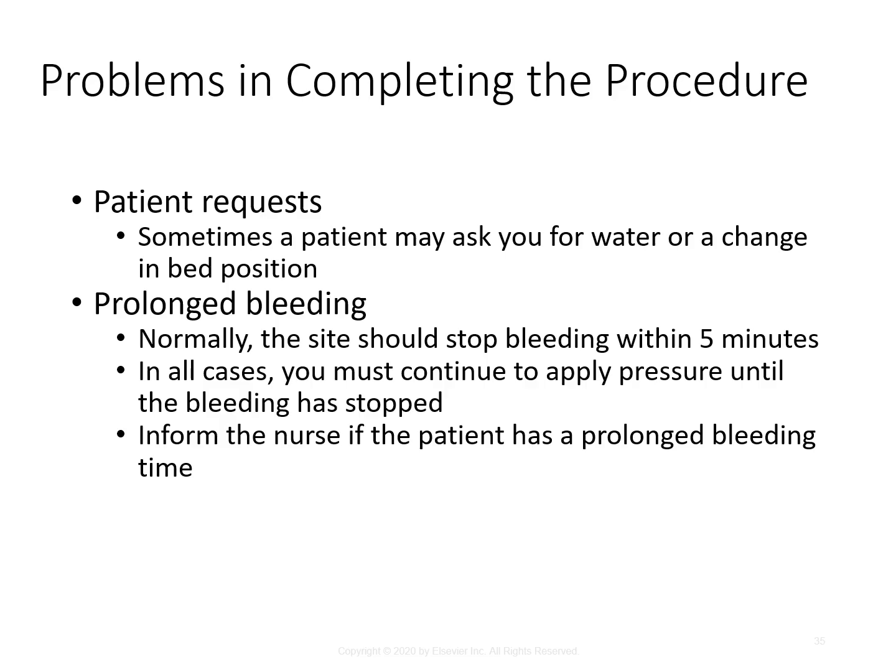Problems in completing the procedure. Sometimes the patient can request that they want something different, right? A patient may ask you for water or a change in bed position. You're always going to check with the nurse before you comply with any of the requests, because maybe they can't have water because they're going to have a procedure. As far as bed positioning, as a phlebotomist, we are not going to be positioning patients. That's going to be up to the nurse, so we're going to let them know that as well for them to help with those patient requests.